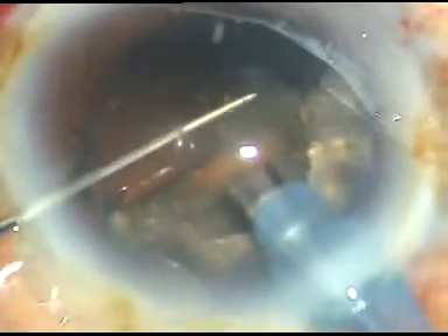Oatly Cataract 3 has a pneumatic cutter with an air compressor system inside — you don't need a gas cylinder. In case a posterior capsular rent occurs, you can very well manage it with the vitrectomy system that it has inbuilt.